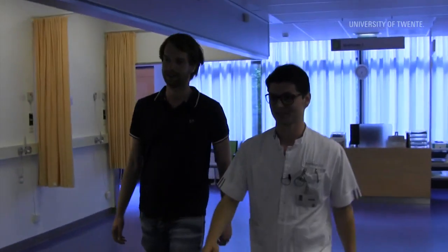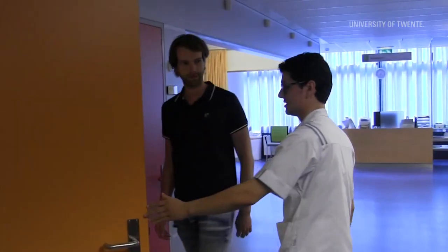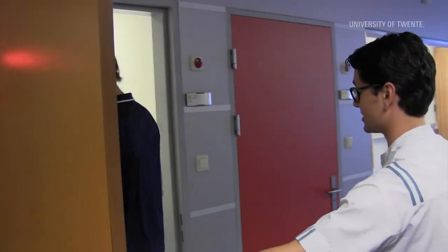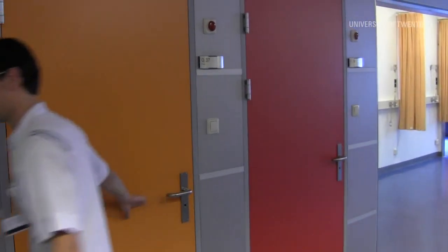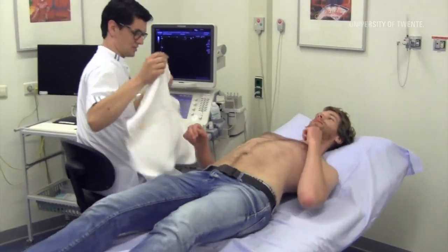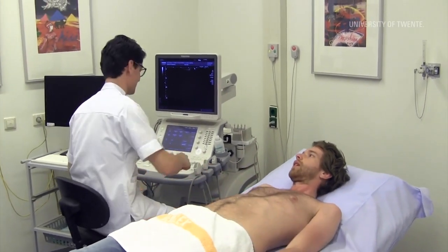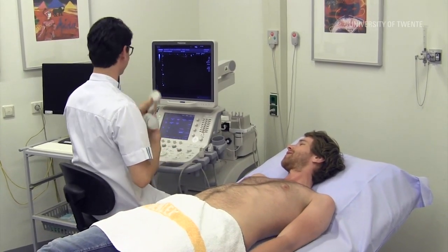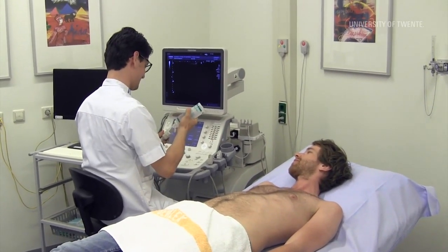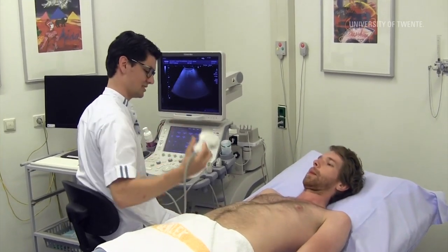Ultrasound imaging is the first imaging method of choice for abdominal pathology. It's easily accessible, has lower costs, and quickly provides the operator with information compared to other imaging techniques. You have to know how ultrasound works before you are able to choose the right equipment, transducer and settings. Only then are you able to make an educated assessment of the images you have acquired.